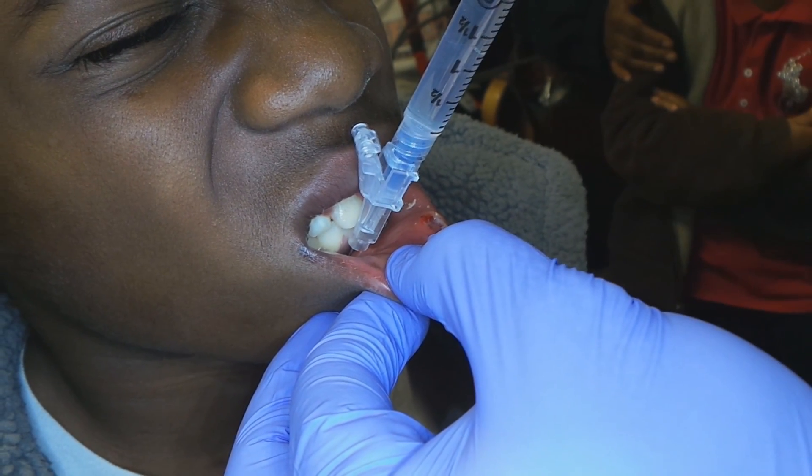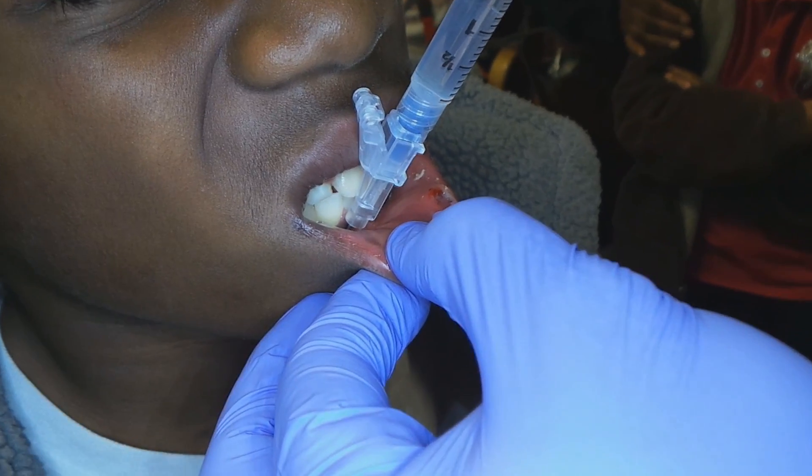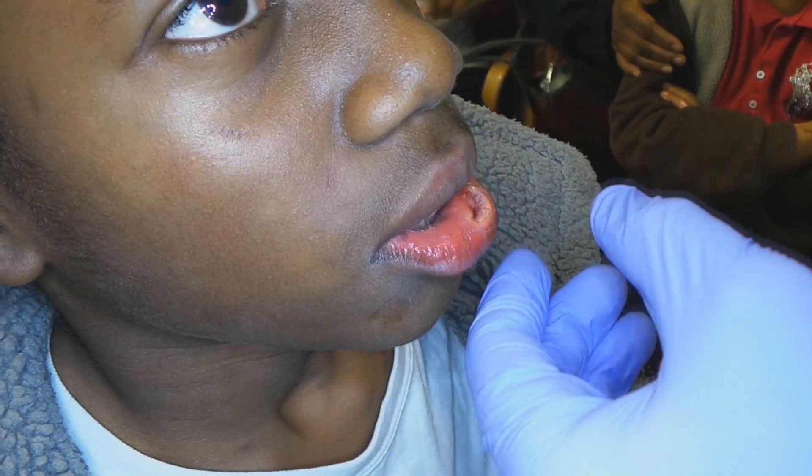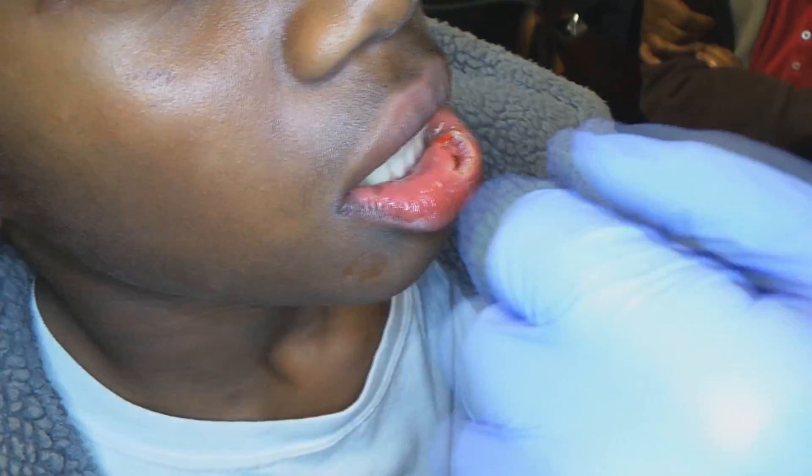There's about one and a half to two cc's. Good job. We'll go do the next one and we'll massage that here in a second. Let's get this next one in.